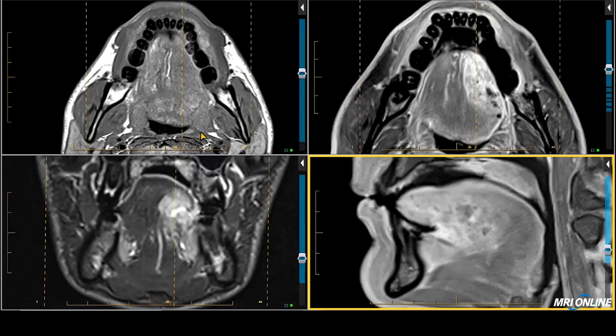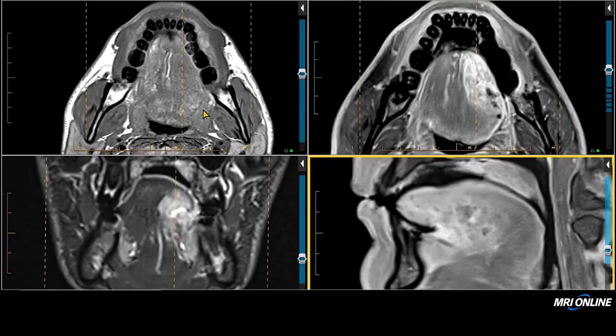This MRI demonstrates a T1 hypo-intense tumour with respect to normal tongue mucosa. I'm now going to draw its margins for you so that you can appreciate what I'm trying to describe. The tumour itself is here. You can see it more easily on the post-contrast T1. On the T2 weighted imaging, it is extending inferiorly into the floor of mouth here. And on the sagittal imaging, it is involving the undersurface of the oral tongue and the adjacent floor of mouth. So therefore, it is an oral tongue malignancy that has extended directly into the ipsilateral left floor of mouth.